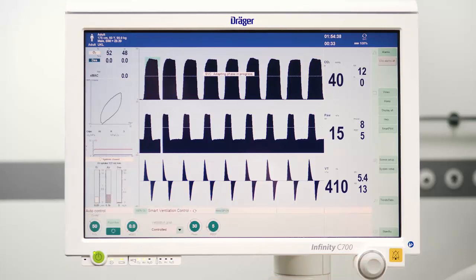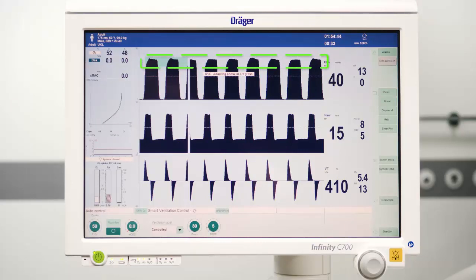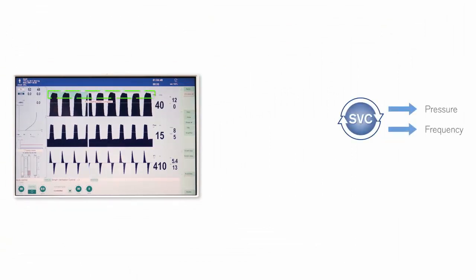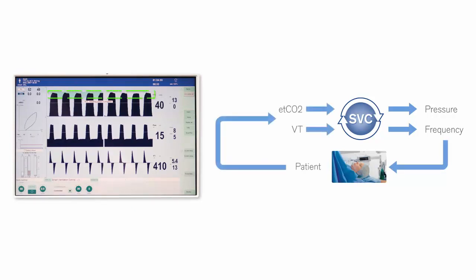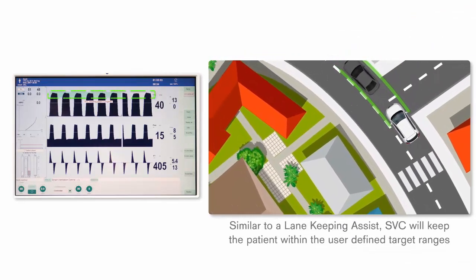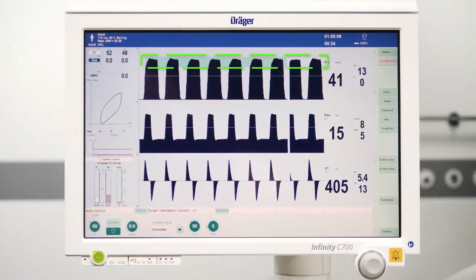Now you can see a green band in the carbon dioxide waveform. This band represents the target range of end-tidal carbon dioxide. By adapting ventilation parameters like the breathing frequency, Smart Ventilation Control will bring the patient into the target ranges of tidal volume and end-tidal carbon dioxide. During the entire surgery, Smart Ventilation Control will assist you in maintaining these target ranges.